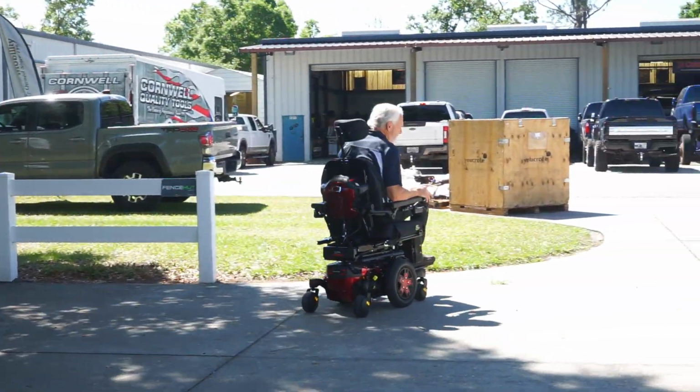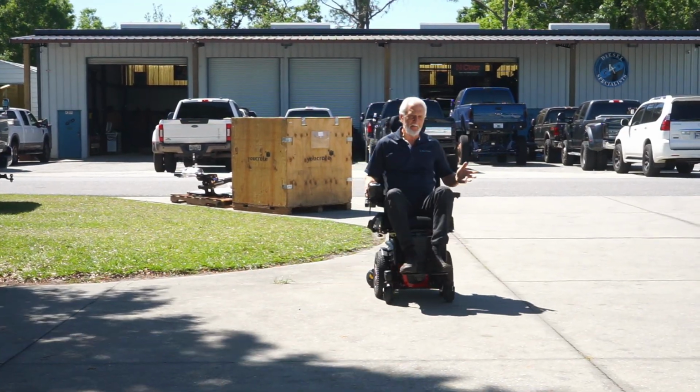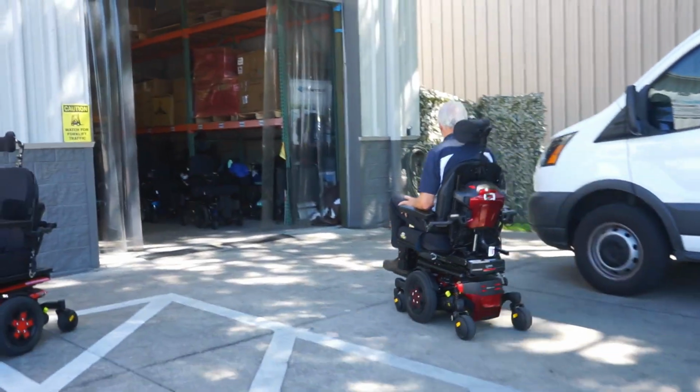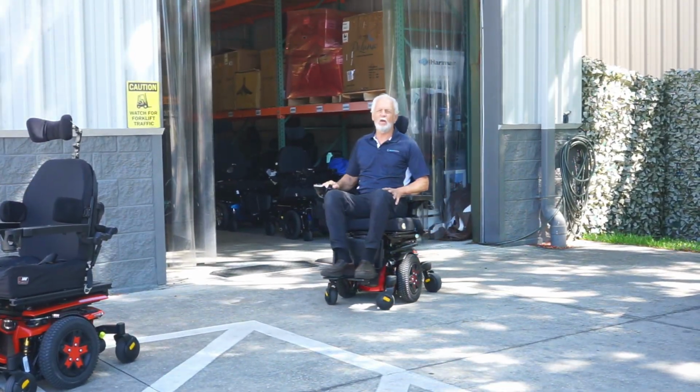So this is the Quantum Stretto. Now you can see that everything would fit me, but the legs have to be dropped down because I have a long leg, and whoever had it had short legs. Top speed on this chair is 6.2 miles an hour, and you can see the suspension, how well it rides.